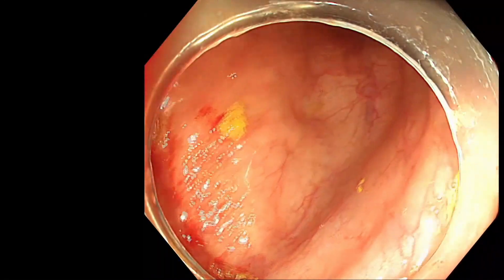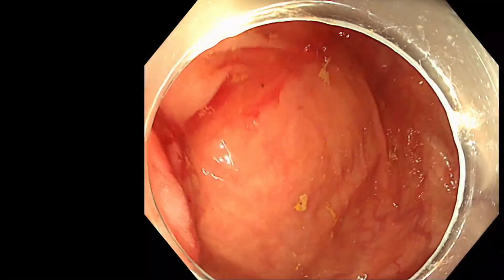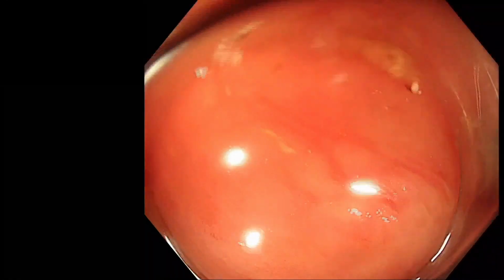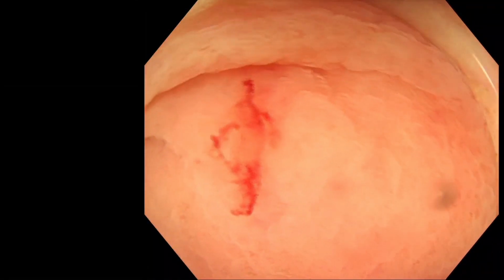So I guess the first question to ask is, has the patient had an appendectomy? I think here we think that the patient has not had an appendectomy. Appendicectomy if you're from the UK.